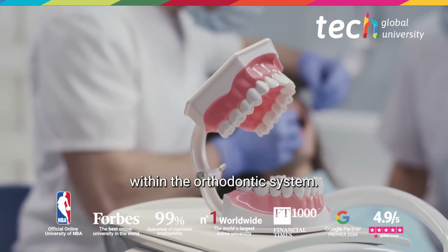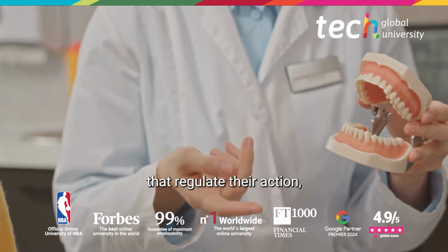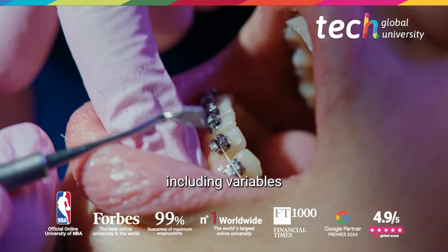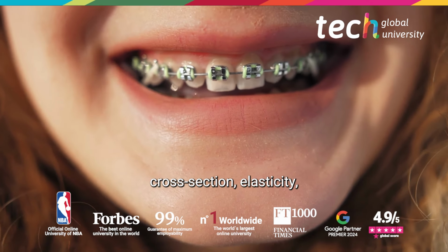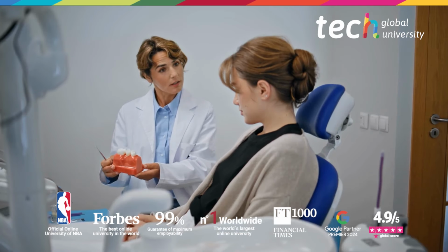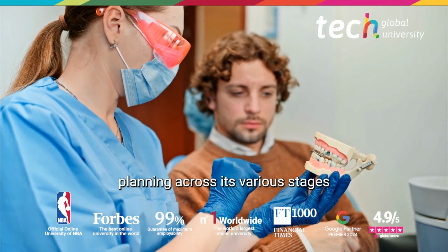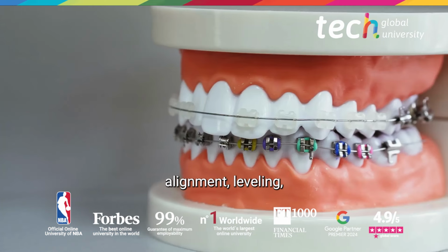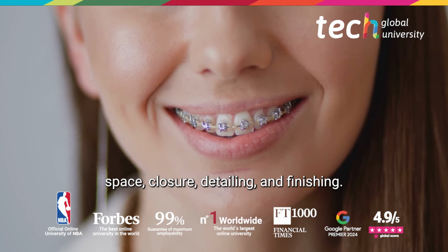orthodontic system. It also addresses the biomechanical principles that regulate their action, including variables such as arch wire cross-section, elasticity, and the point of force application. It further reviews treatment planning across its various stages: alignment, leveling, space closure, detailing, and finishing.